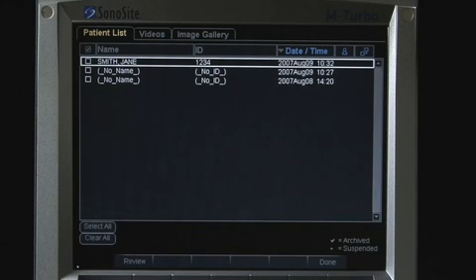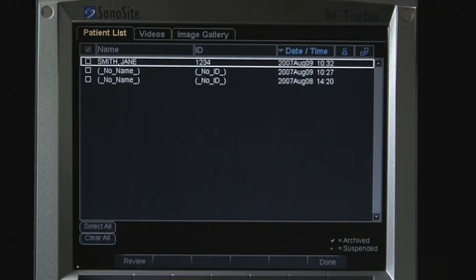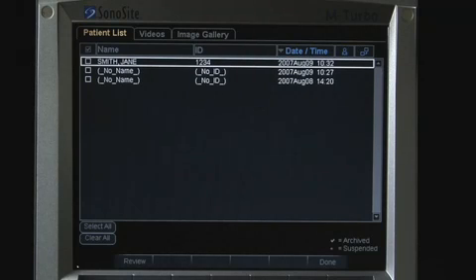The header at the top of the screen identifies patient and image information for the study. This includes patient name, ID number, date and time of the exam, the sonographer's initials, and connectivity: completed, suspended, or archived.